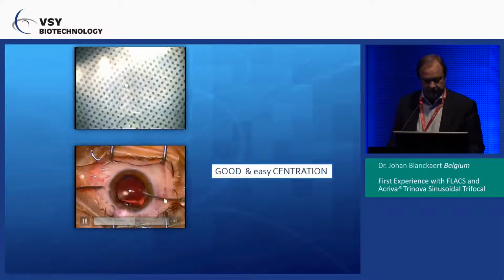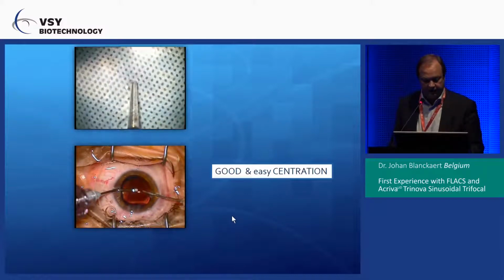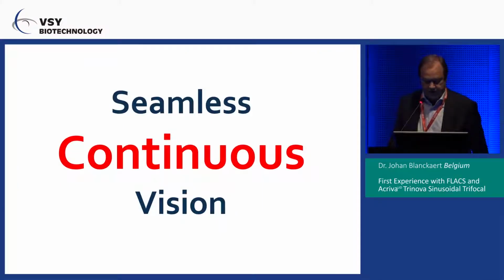This is the same type of image. You clean the viscoelastic from behind the IOL, and then you see that it's good and easy centration.